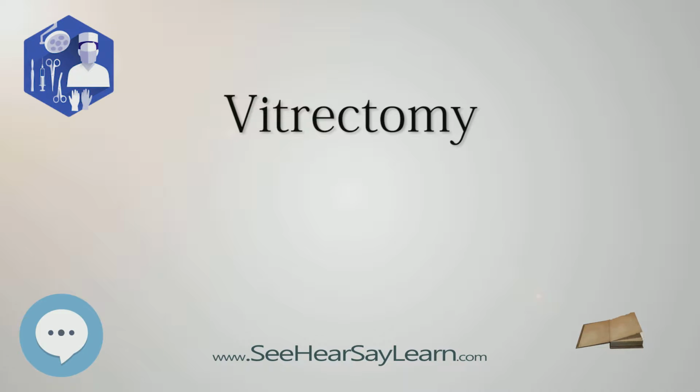Pars plana vitrectomy. Vitrectomy was originated by Robert Machemer with contributions from Thomas M. Aaberg, Sr. in late 1969 and early 1970. The original purpose of vitrectomy was to remove clouded vitreous humor, usually containing blood.